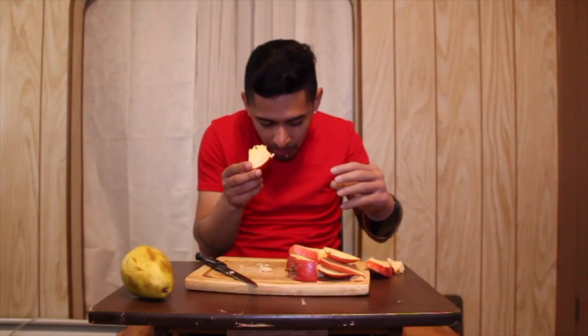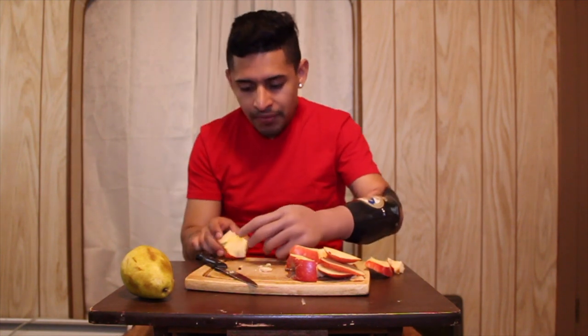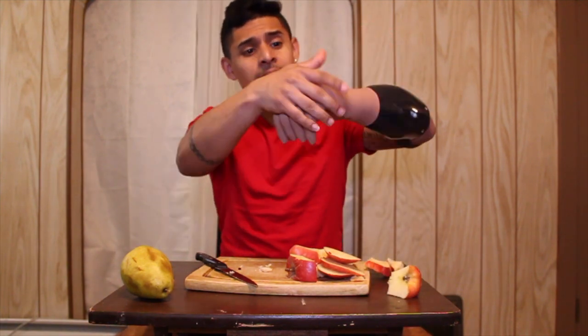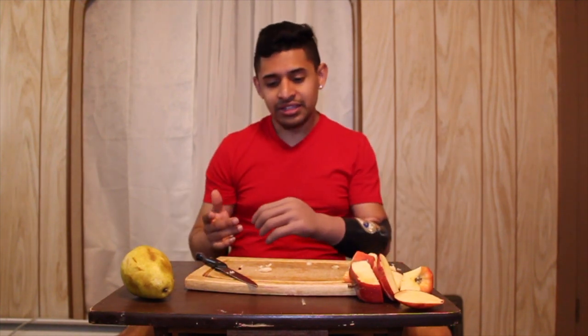Oops, I dropped them on the floor. Now Alex is going to try the pear. It's really hard with a prosthetic hand to cut food, but sometimes it's funny because you're trying to cut it.